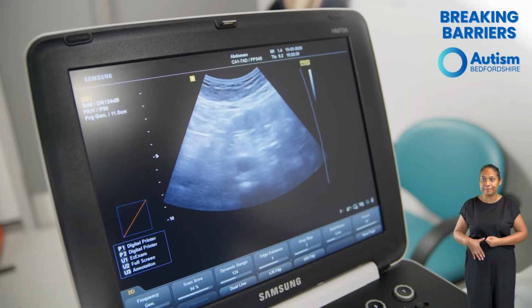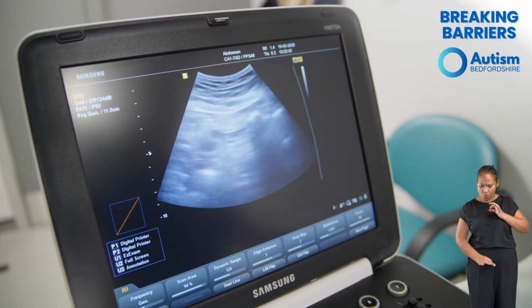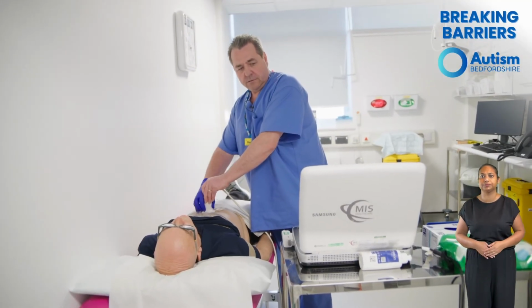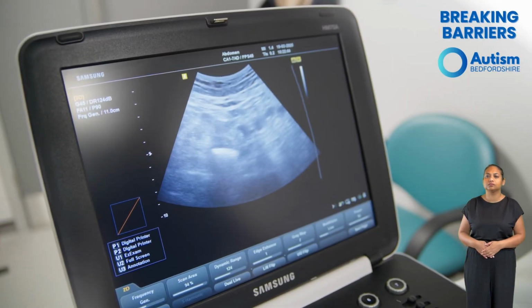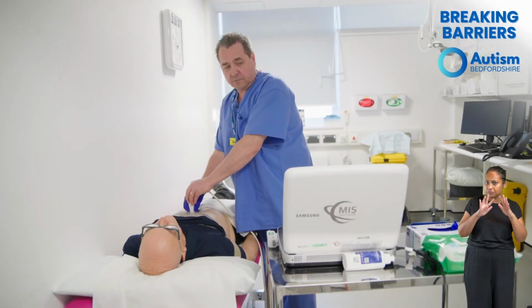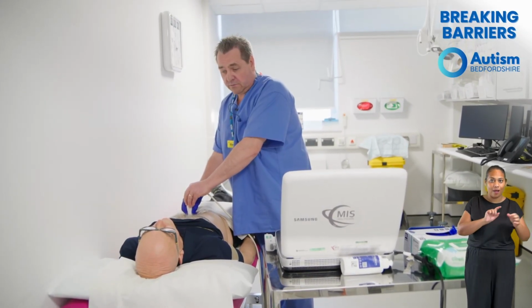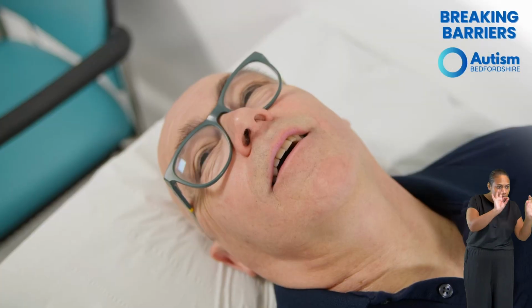Now I'm going to look at the full length of your aorta, and everything looks absolutely fine. I will take an image of that and measure it for you.